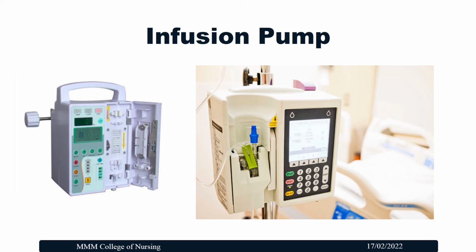Infusion pumps are electronic devices which help to administer fluid in a controlled manner. In this, a larger amount of fluids can be administered. It may be medication, IV fluids or nutrients. It is supported with a battery backup and it has to be recharged regularly. This device can be conveniently fixed along with the IV stand.